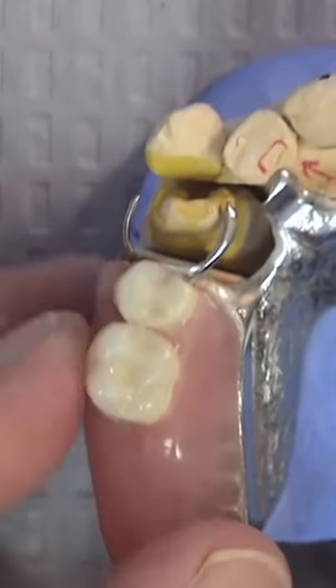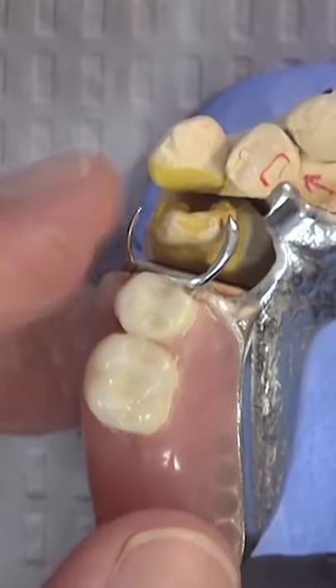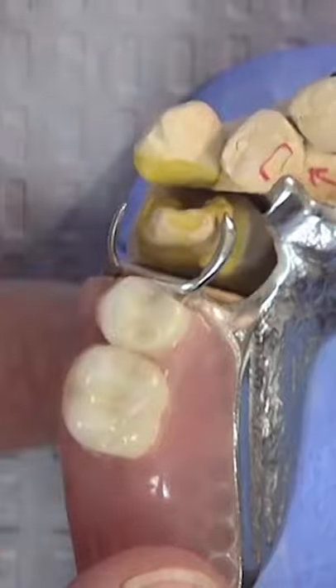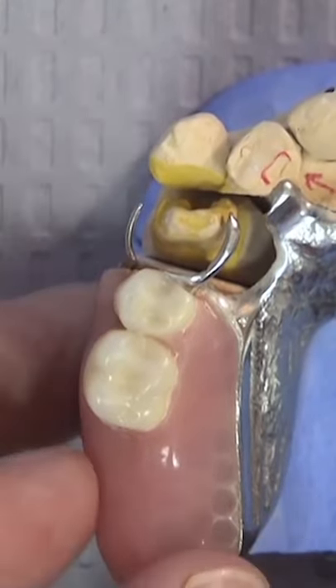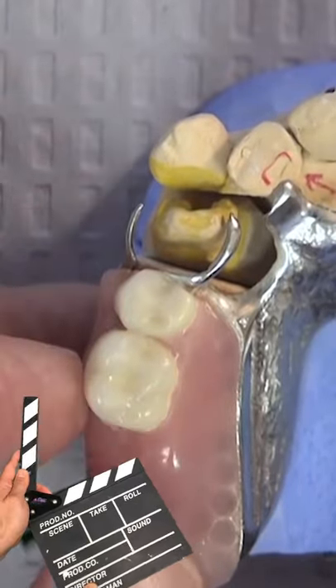It's clear that what happened was this partial shifted to this side because the one area of contact, the one area of retention — this crown has been taken off — and so now these clasp arms are floating in space. There's really nothing to prevent this from rotating to the distal or sliding down a little bit on the palate because of this.